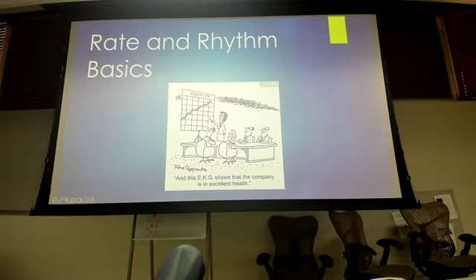What about a P wave? Who cares about it? Well, the atria care about it, right? Because it's coming from the atria. So what are the parameters that indicate a normal P wave? You gotta know that. Because as we continue on, we start talking about things like hypertrophy. It's going to maybe affect that P wave and how that P wave is different. So you've got to know what the normal parameters are.